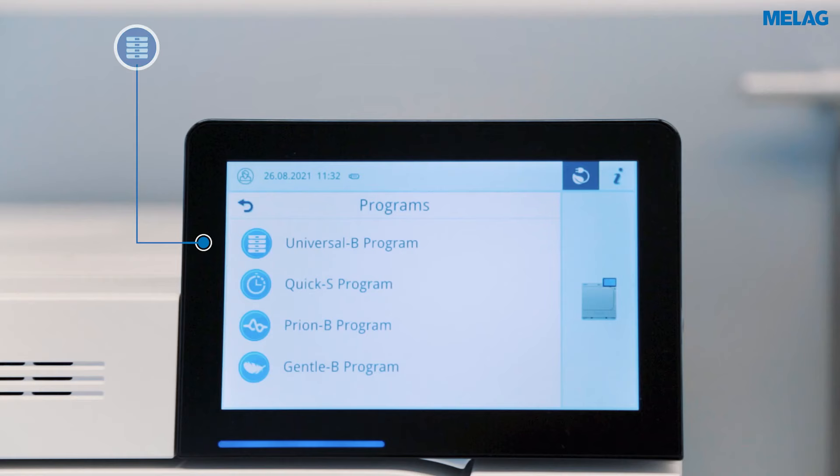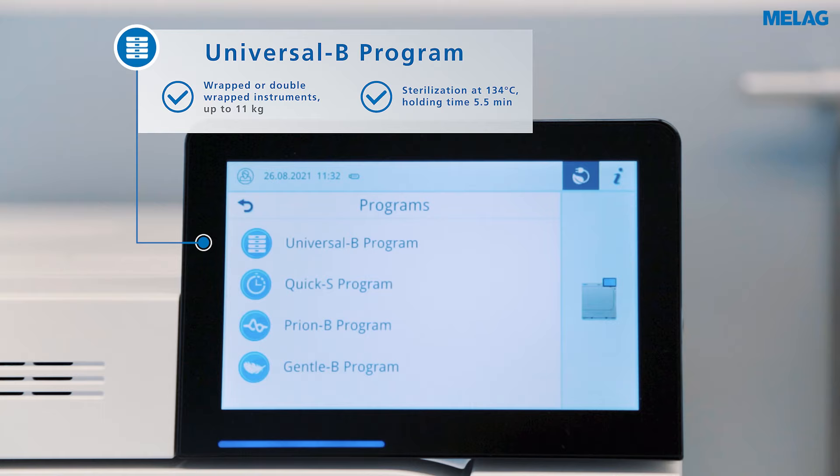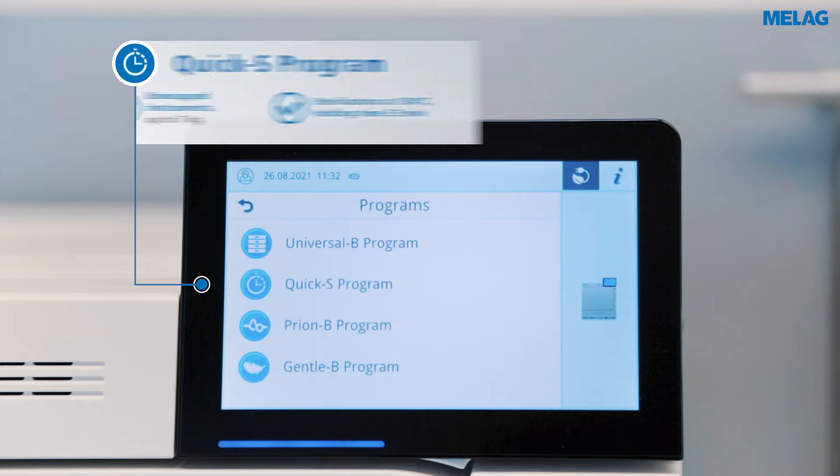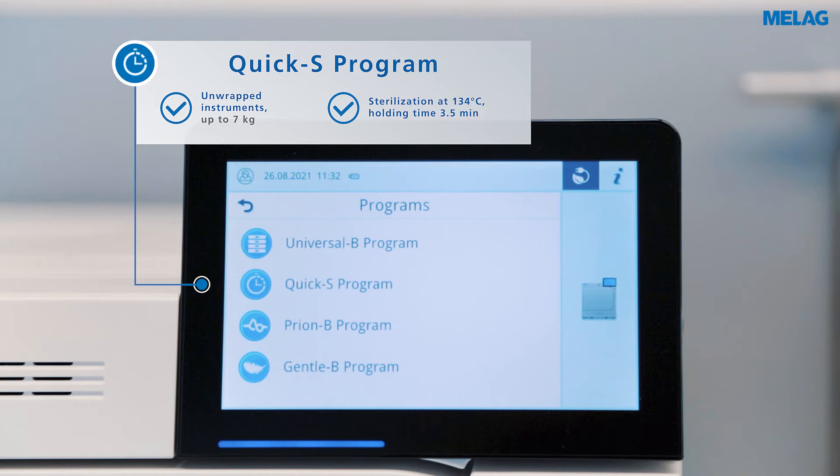The Universal program offers you maximum flexibility — sterilize up to an 11 kilogram load at 134 degrees Celsius. The Quick S program guarantees the shortest cycle times for sterilizing unwrapped instruments of up to 7 kilograms.